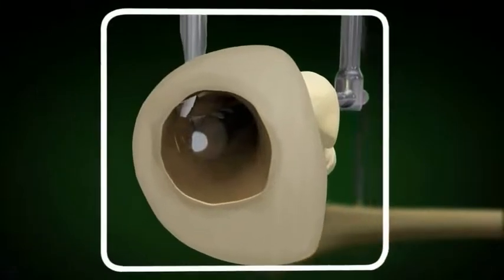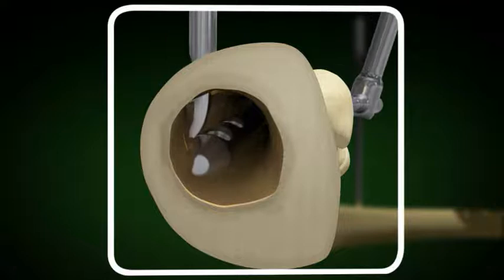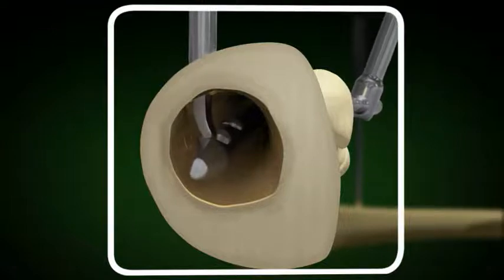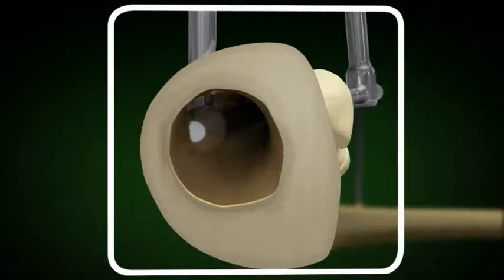Observe the curved slot finder. The curve can be adjusted 180 degrees to enter the slot in the nail. Rotation is very important when using the curved slot finder. The surgeon should have his hand on the L handle and the curved slot finder.